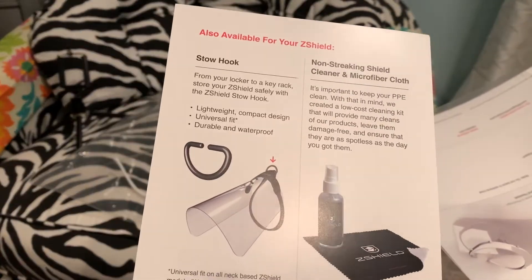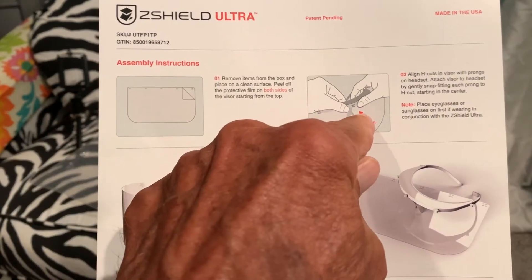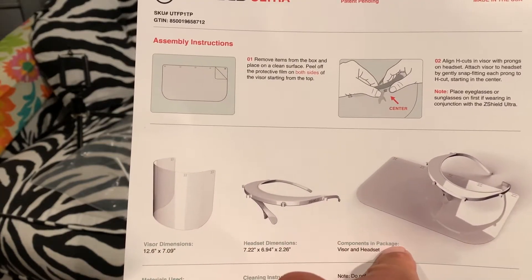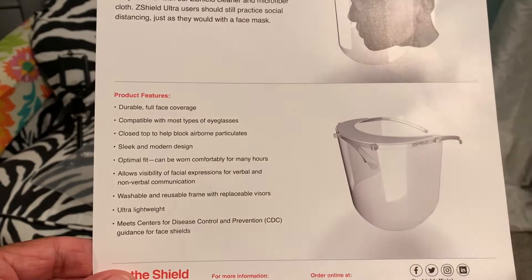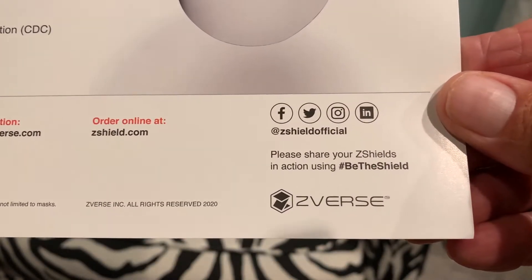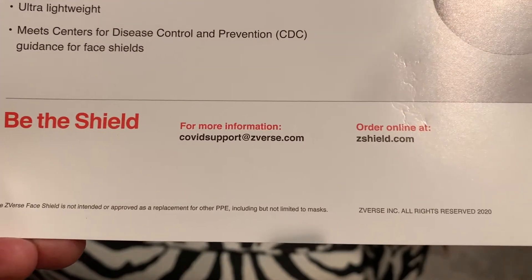There are instructions on it — put those over there — and this is the shield itself. Set that down, and these are the instructions. You've got to remove the film and then find the center and smush it on. That doesn't look too hard. And that's the stats on it — all the information. If you want to screenshot that, it's got all their contact info, email, and website.